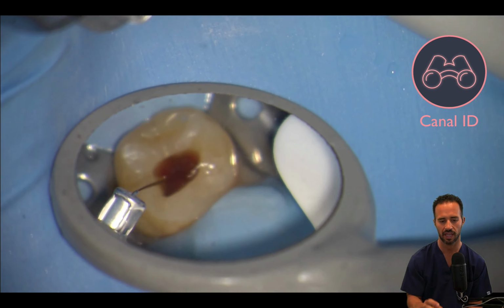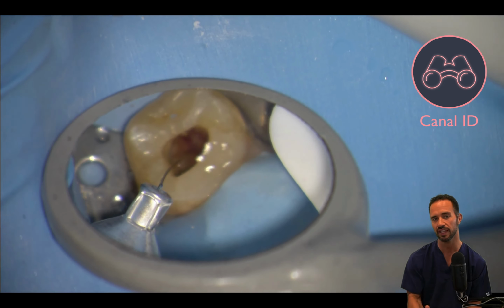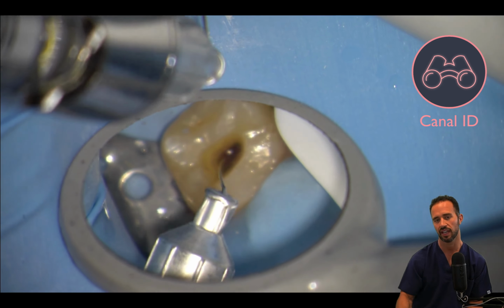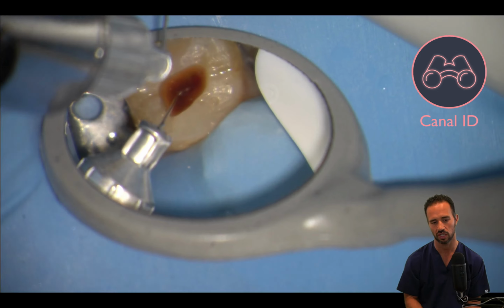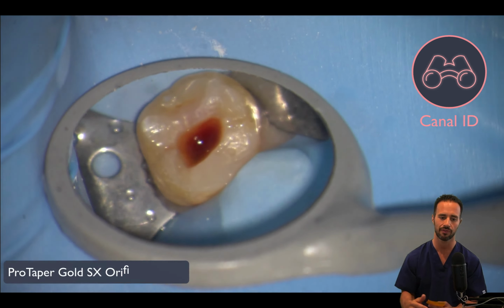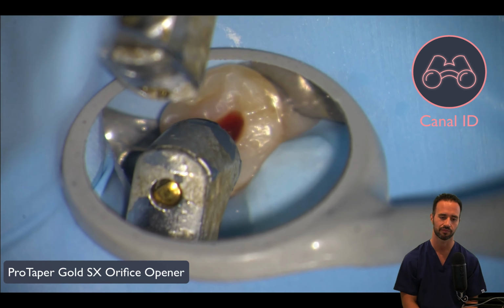So I've got Septocaine loaded with a short needle that's bent 90 degrees, and I'm just flooding that pulp tissue with the Septocaine in order to get a higher level of anesthesia. This patient had a negative cold verification after anesthesia, but even still had a little discomfort. And so don't be surprised if you have to perform intrapulpal anesthesia fairly regularly.